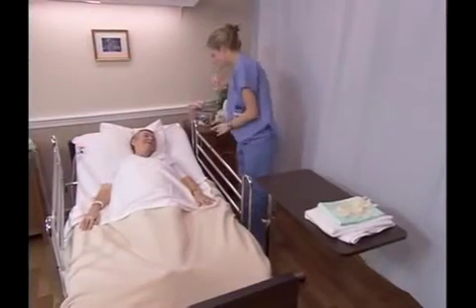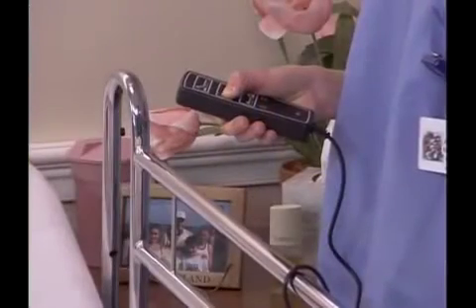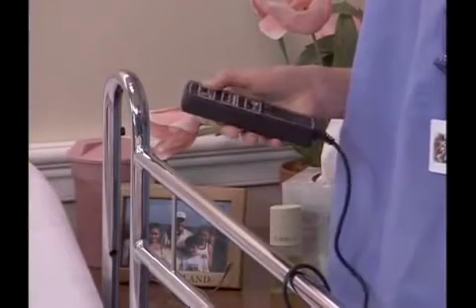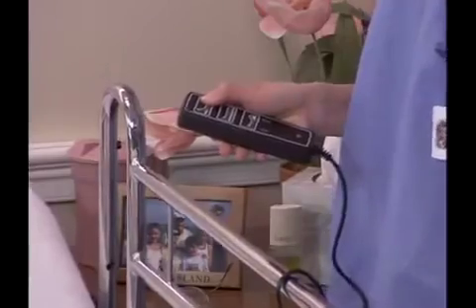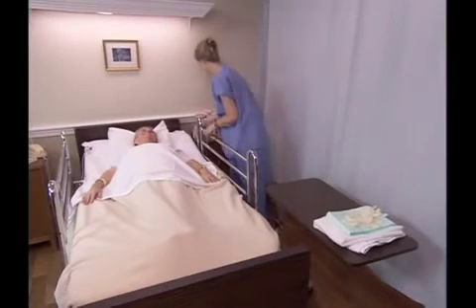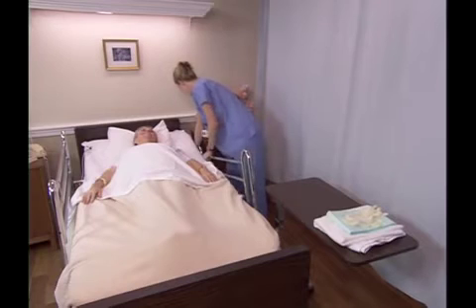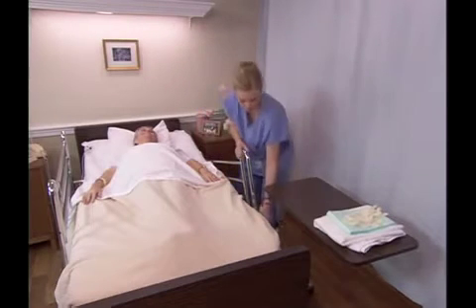Hello, Miss Niall. Begin by positioning the bed at a comfortable working height to promote good body mechanics. Then, lower the head of the bed so that the bed is flat as tolerated. Make sure the wheels are locked. If the side rails are in use, lower the side rail on the working side of the bed. The side rail on the opposite side of the bed should remain up.